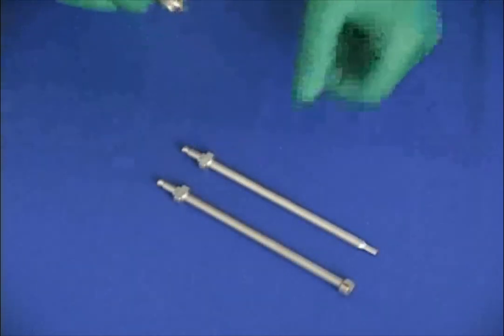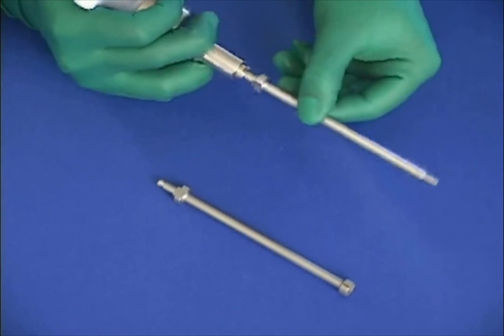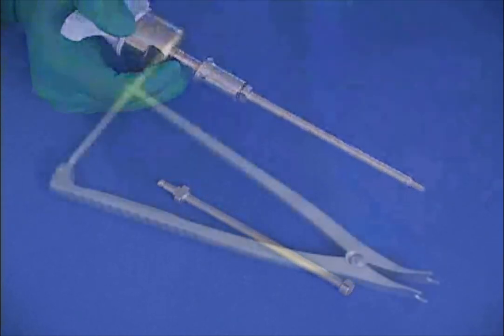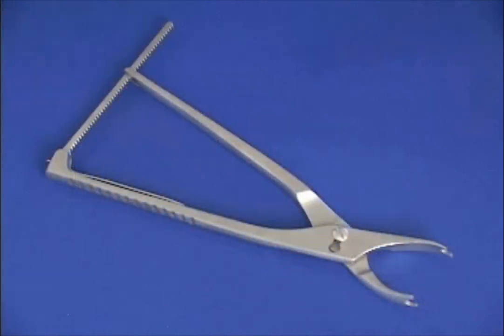The cross-connector cam wrench and hex wrench are loaded into and released from the torque limiter by pulling back on the Hudson fitting of the torque limiter. The distractor is utilized to distract between segments. The compressor is utilized to compress segments.